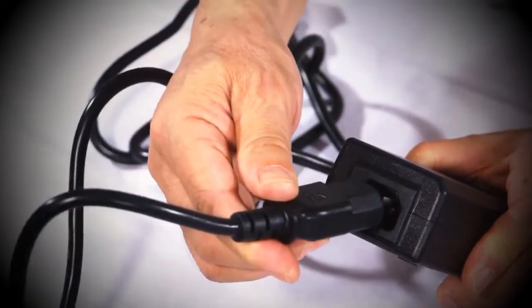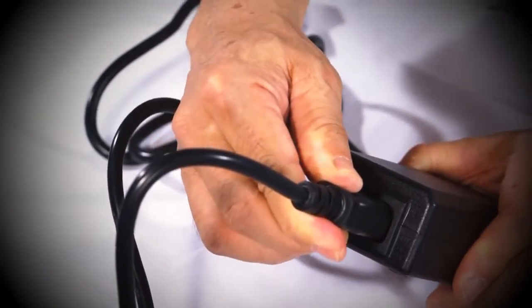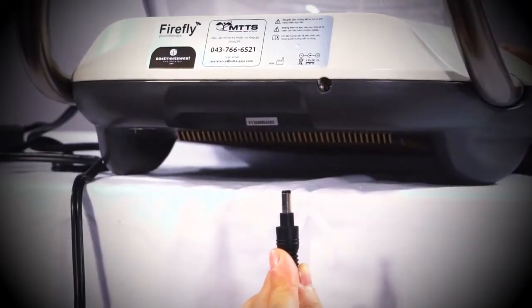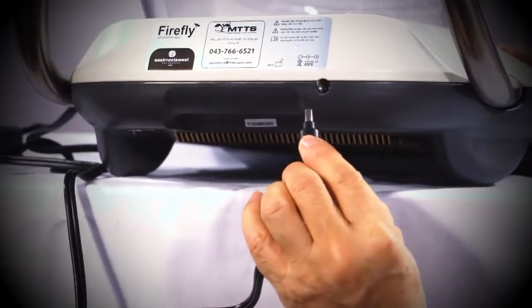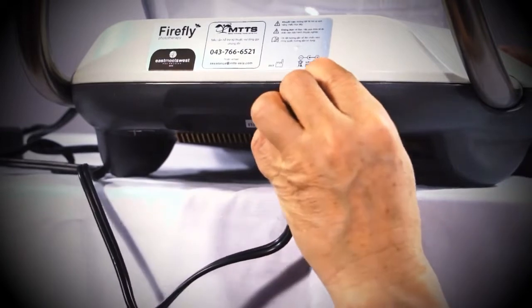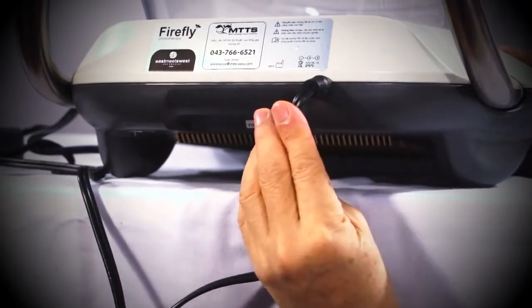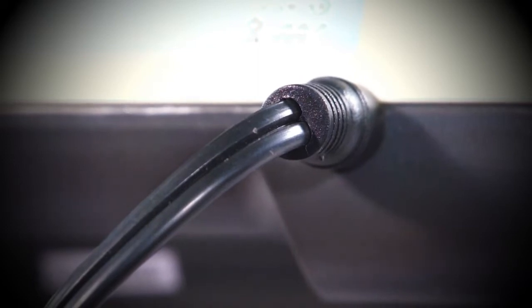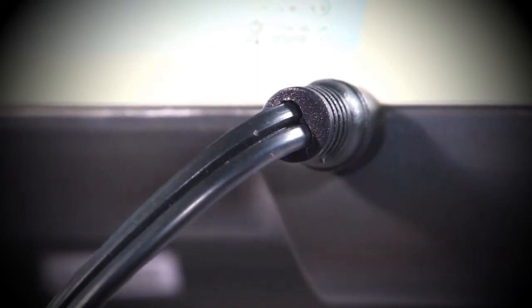To begin the installation, first connect the AC cord to the power supply box. Next, connect the complete power cord to the Firefly by inserting the round pin into the back of the main unit. Ensure that the connection is secure and fully inserted.